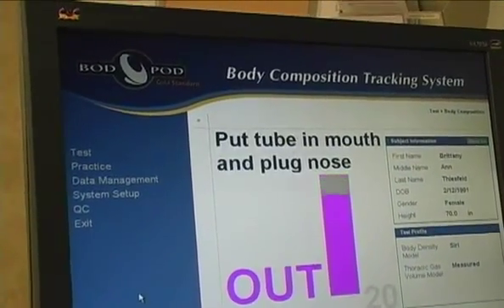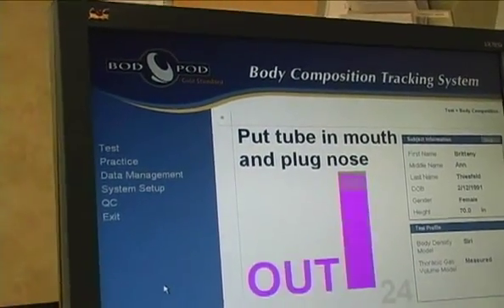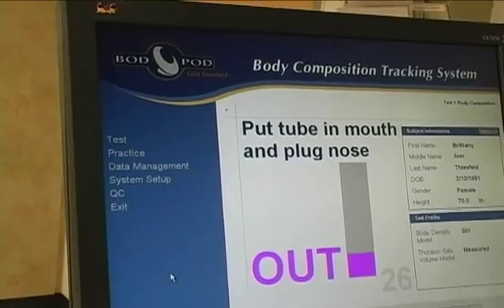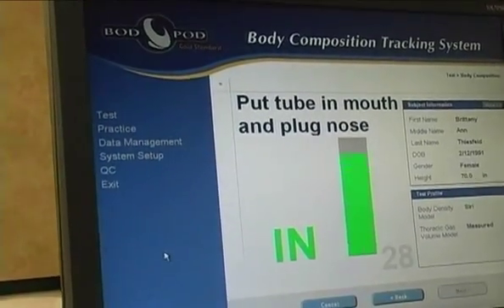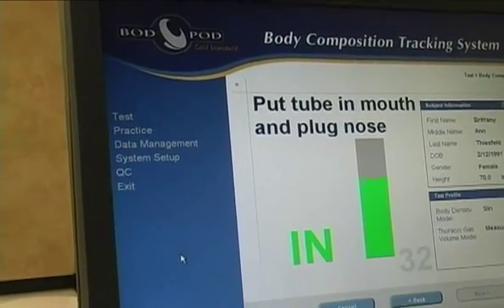Prepare to put tube in mouth. Now put tube in mouth. She plugs her nose. Perfect. This will go about 10 seconds. Here's the cadence I want her to do. So it's in, out. So try to follow that. And then it's going to say prepare to huff, and then huff.